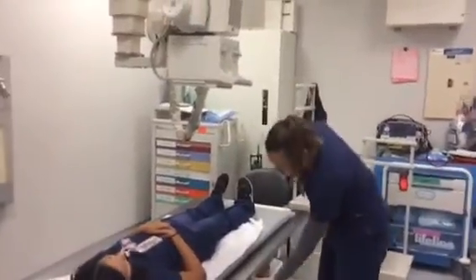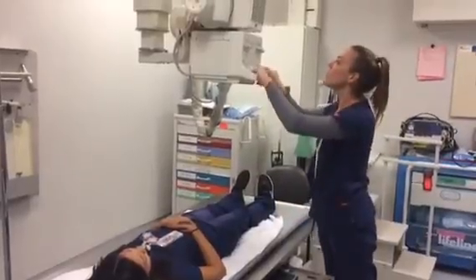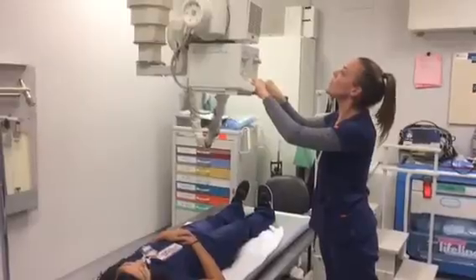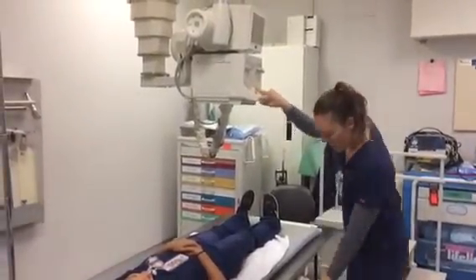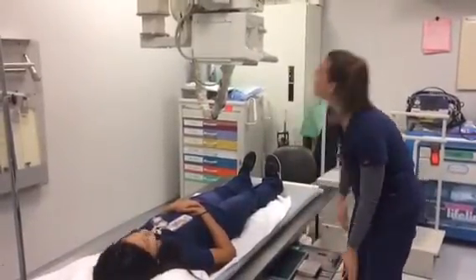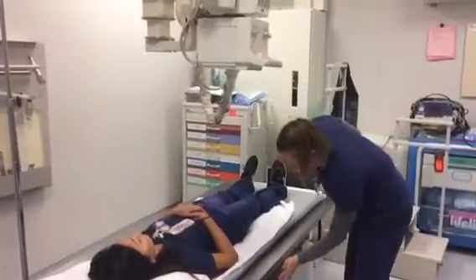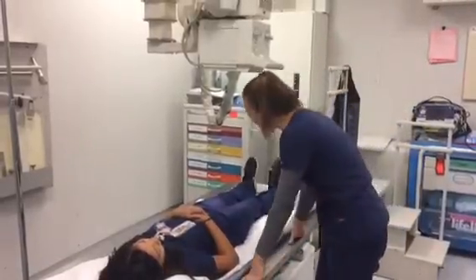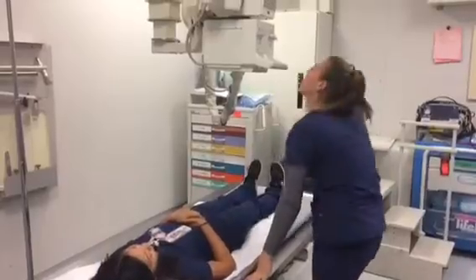So now I'm going to be checking my tube angulation, making sure that it has a 5-degree cephalic angulation and that it is lined up with my IR. Okay. Now that the tube is detented and ready to go, I will be moving the patient on the table.